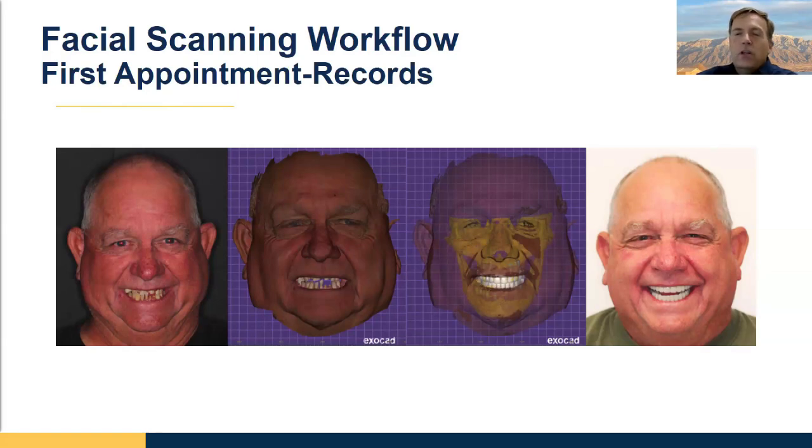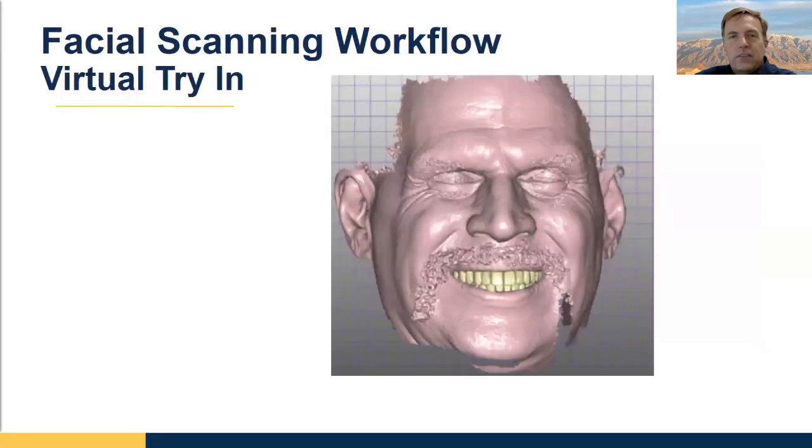I'd just as soon send these to the patient, and you can get them hooked up with the exocad web viewer and they can actually look at the design themselves if you want. So it kind of makes you the cool high-tech office.